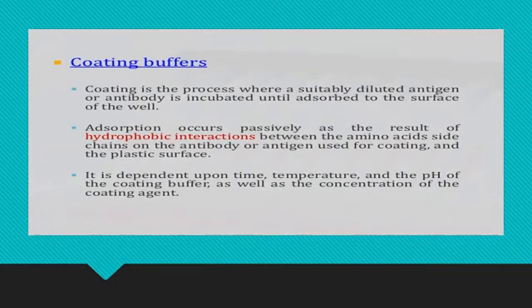It is dependent upon time, so adsorption, how strong the adsorption of the antigen or the antibodies on the plastic plate يعتمد على التايم. يعني sometimes 1 hour is not enough, so نسوي troubleshooting، يعني شلون احنا نصلح الاكسبيرمنت مالتنا، نعرف وين خطأنا، نطول الانكوبيشن تايم حتى يصير عندي الانتيجين or the antibody is absorbed very well to the plastic surface of the plate.